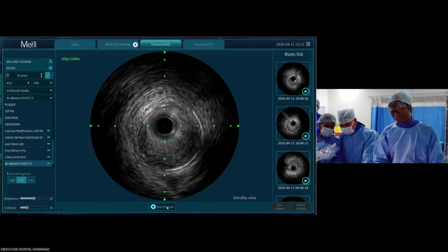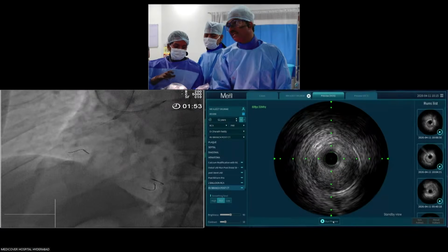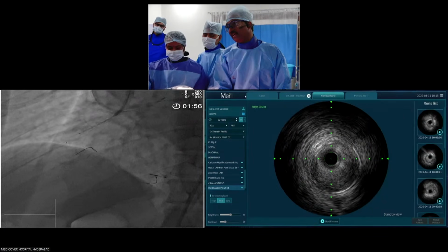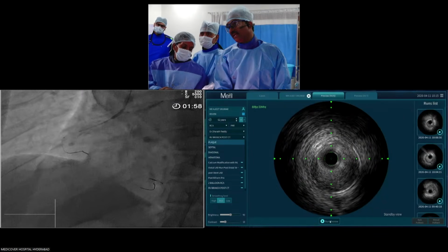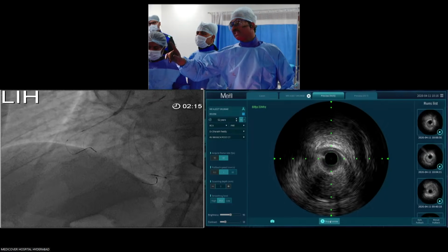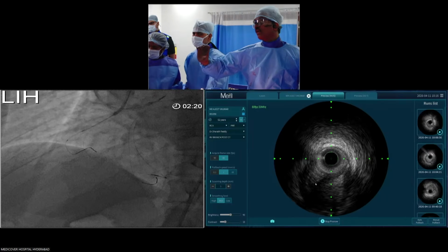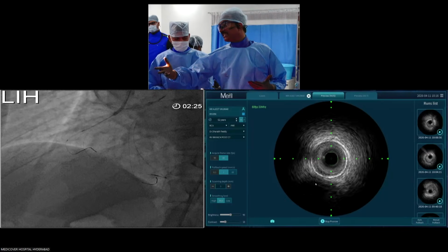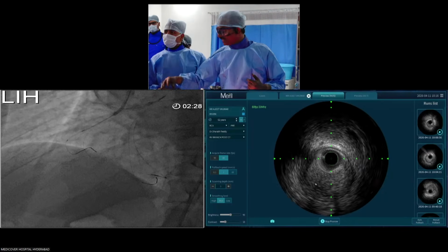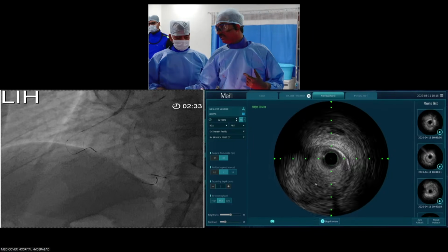You can clearly see a flap and the overlap of fenestration onto the RV branch much better than from the RCA, but of course, we can see from both sides. Whatever flap is occluding the RV branch, whether that got fenestrated or not, I have to see even before I take a stent. If there is no fenestration with the balloon, then it is going to close.